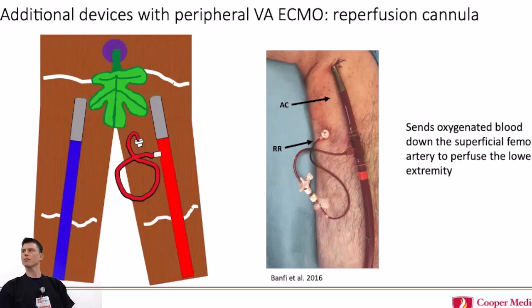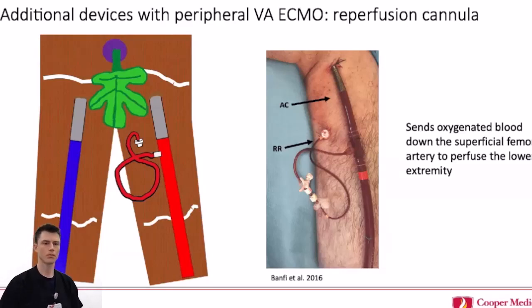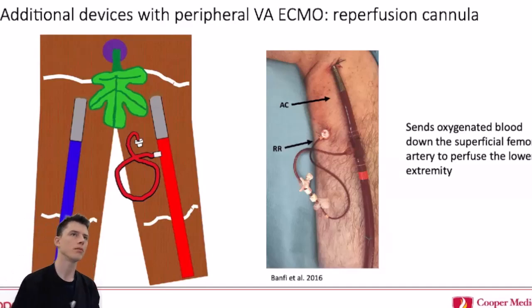So that's why the tissue ox monitor and things, and sometimes just using color to make sure that they have good flow. There's a lot of questions you get sometimes when they have no pulse, but the leg's still warm. If their foot were to go cold, would we be able to ask you guys to check on ultrasound? Yep, that plus the foresight would be helpful.